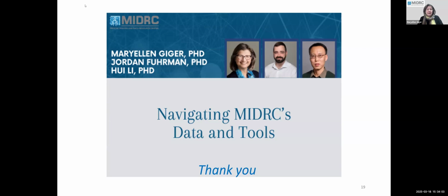Let's see. There's also a question, curious how hard it is to submit these data types into MIDRC. Well, we're constantly intaking image data from medical institutions and others. We take in DICOM medical images with some metadata. If you have data that you would like to contribute, please go to midrc.org, and I can bring it up potentially.